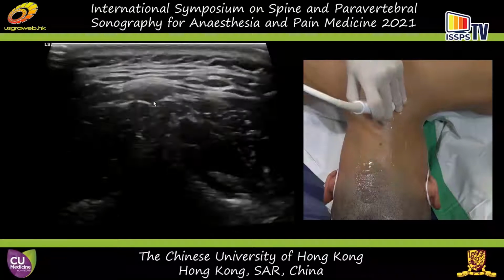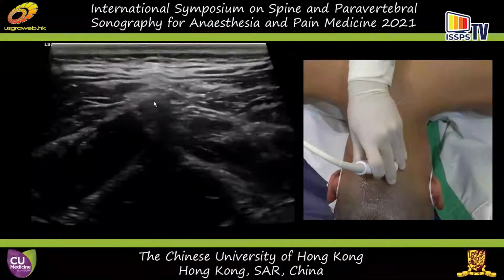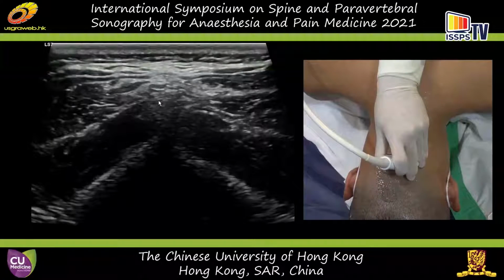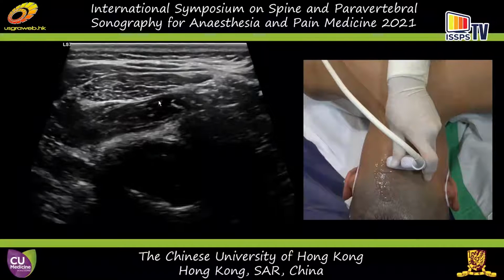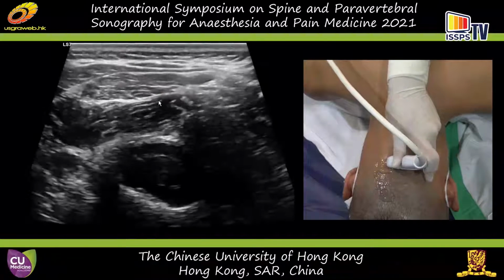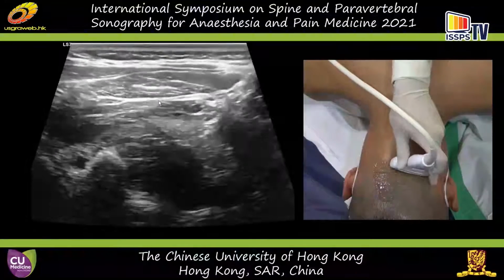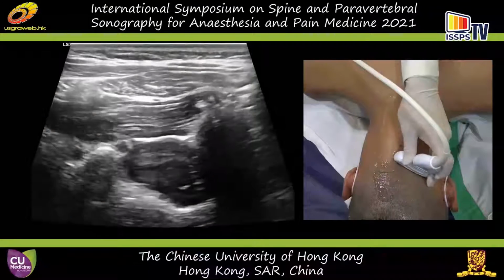P1 right here. So when we go to this, the spaces between the spinous processes here. In fact, when we increase the depth and lower the focus, increase the gain a little bit, now you can see the home position for this posterior suboccipital region.